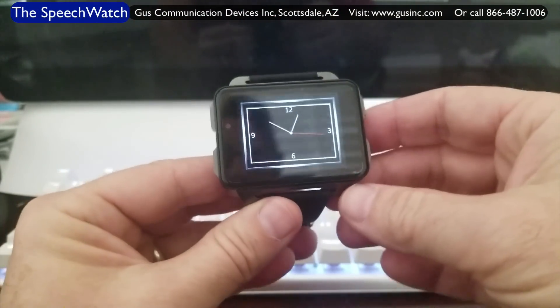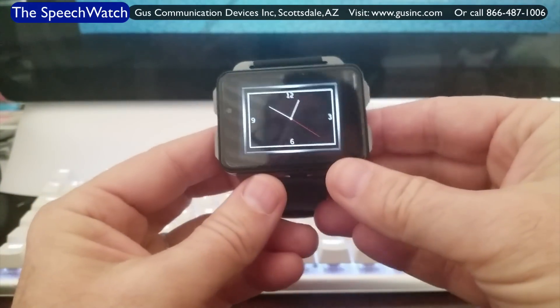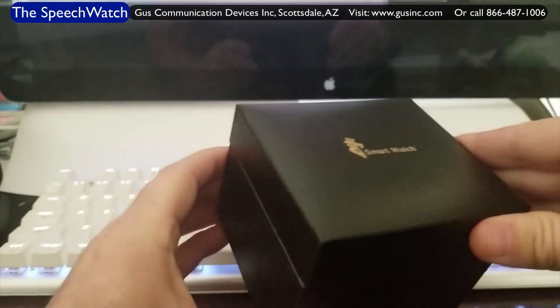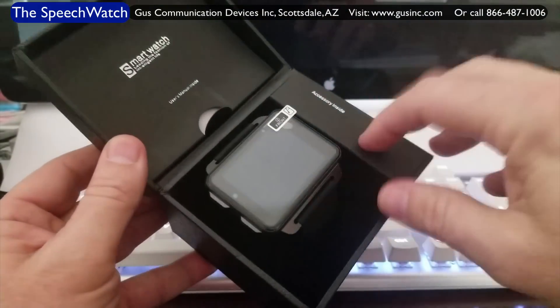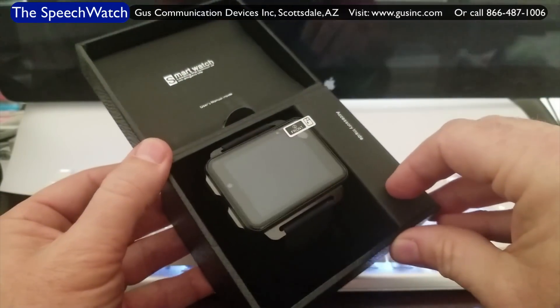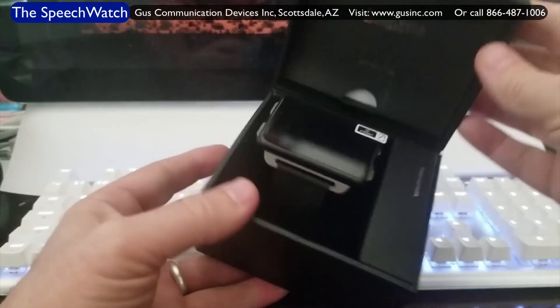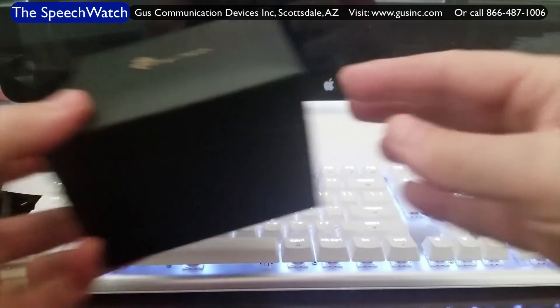This is a quick introduction to the new Dr. Helped Speech Watch. Let me show you how it arrives and give you a quick tour of how it works. When you receive it, it comes in a nice gift box. The watch is inside, along with some simple instructions. Inside the accessories box is your USB charging cable and a screen protector. It has a 2.2-inch screen that works great, especially for speech output.